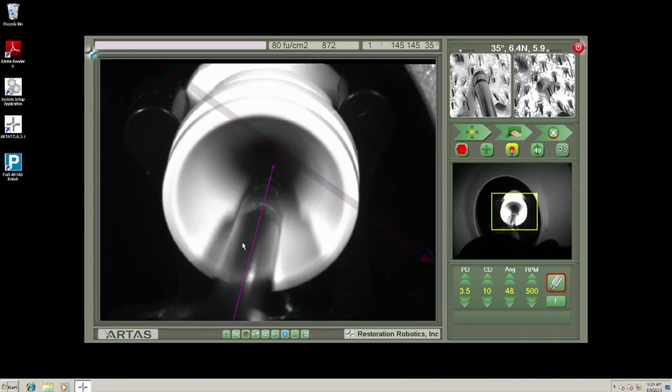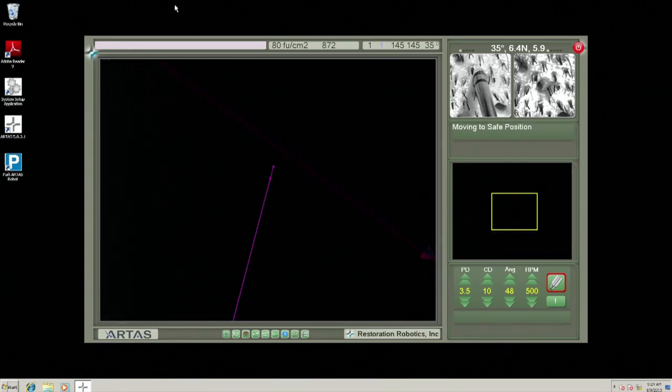Right. Well, I'm doing it in my office that's behind a one-way mirror in another room, with a monitor, with an audio monitor, and two different cameras that I can see the patient in real time. But with our webinar, we have a couple extra cameras. So I have one that's a clear view of the procedure going on, and then a direct visualization through the window, and I'm using this to multitask. I can answer emails while I'm doing this on an iMac that's right next to me.